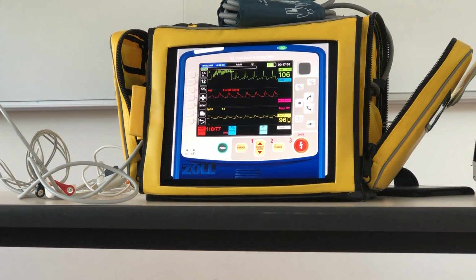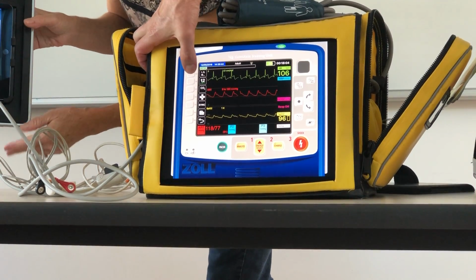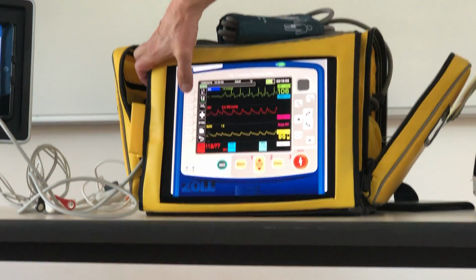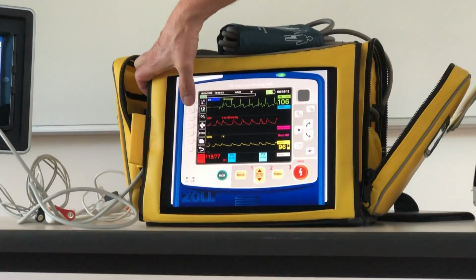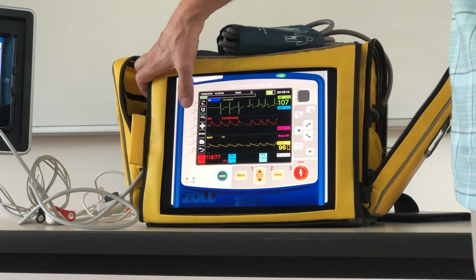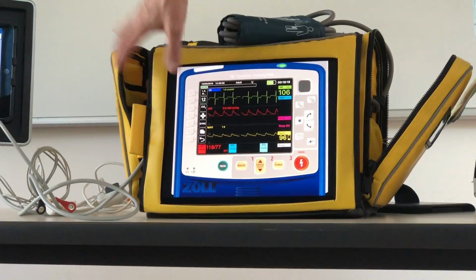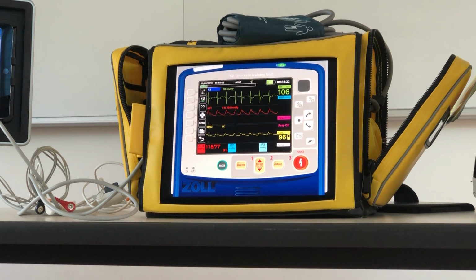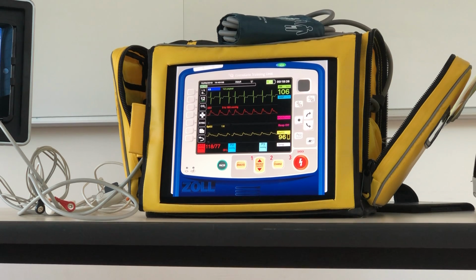You can change the lead that they're looking at. So if they want to change leads, they hit the lead button and it'll scroll through. So I just went from 2 to 3, AVR, AVL. Yeah, so you can scroll through all the leads, assuming that they've hooked up all the leads, right? So if they don't, there's actually an option within the ECG where you can go in and change the leads.